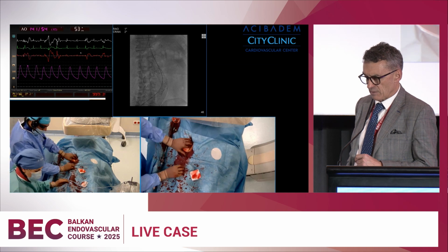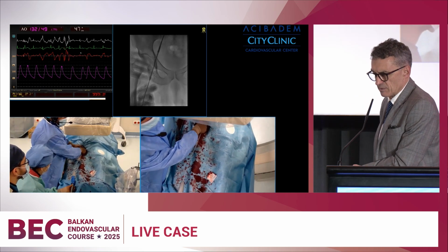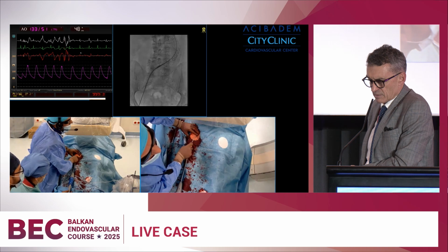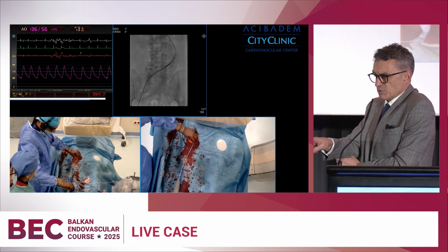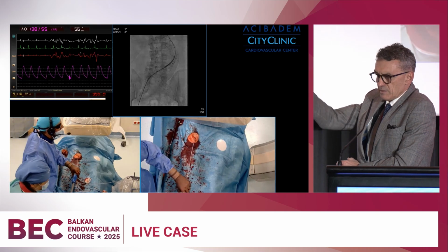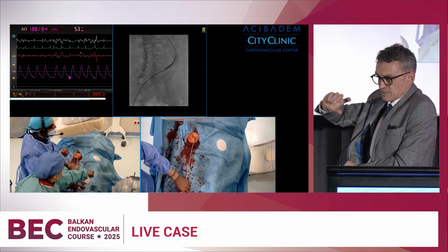If you allow me, I will open your presentation. I didn't see it, but I can guess what I will see, and I will explain several tips and tricks about it. So you see, we are on the place. You saw the journey of the stent graft over the wire, and in such a way we are aiming at the landing zone, proximal and distal.